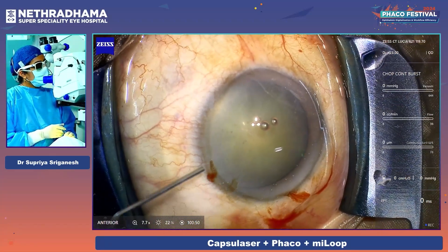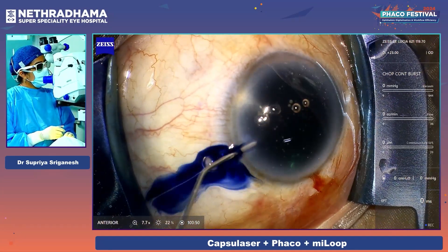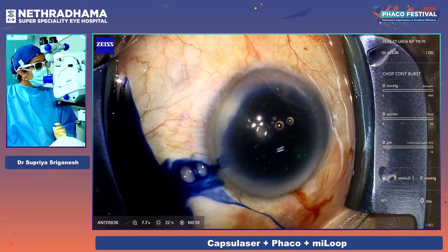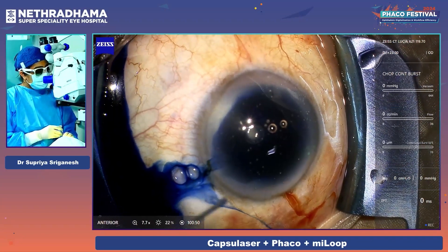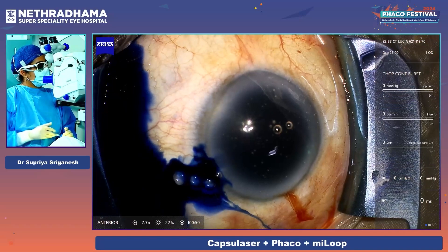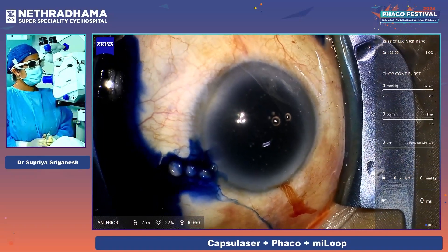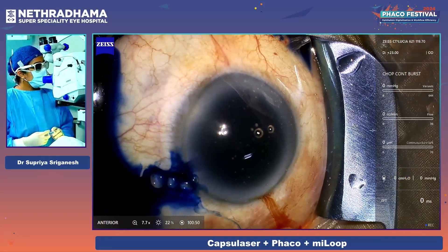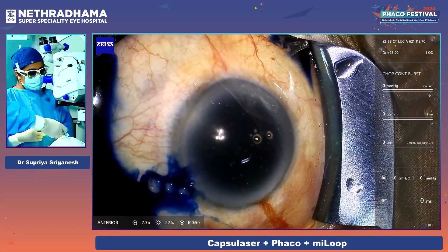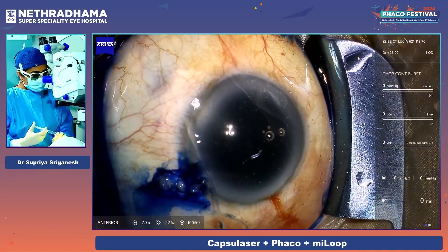This is trypan blue dye of a higher concentration. I'm going to inject the trypan blue dye. After injecting the dye, we actually have to wait for about 60 seconds — just going to inject adequately. The staining for this capsule laser system is extremely important. We need to make sure that the staining is even all over the capsule and that it's adequate.